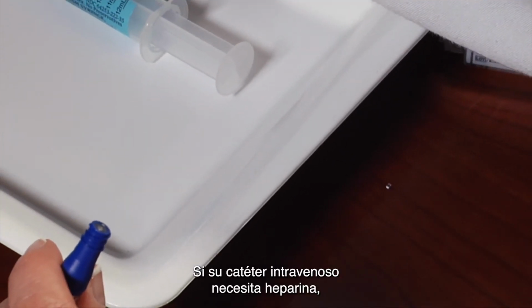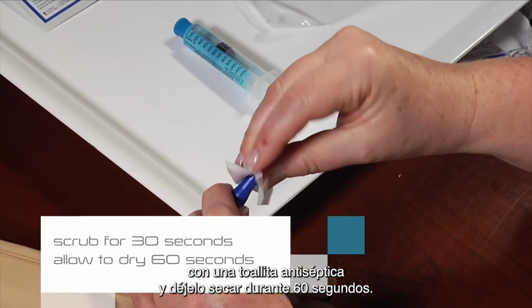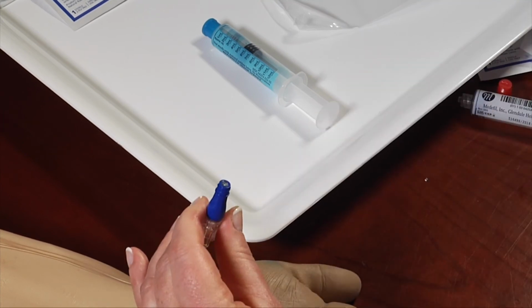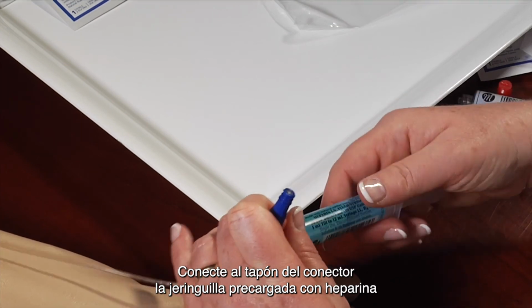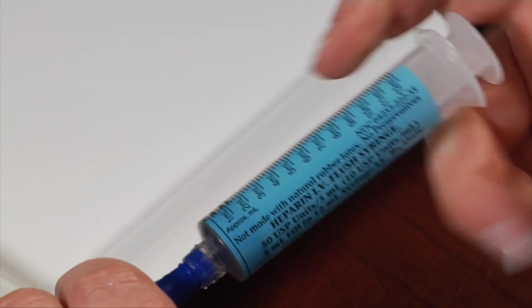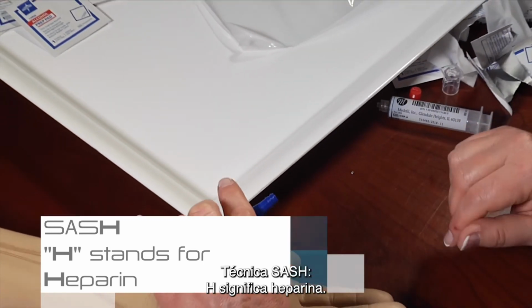If your IV catheter requires the use of heparin, scrub the hub of your injection cap vigorously for 30 seconds with a new antiseptic wipe and allow to dry for 60 seconds. Attach the pre-filled heparin syringe to your injection cap and flush the catheter with the contents. Disconnect the heparin syringe. SASH method. H stands for heparin.